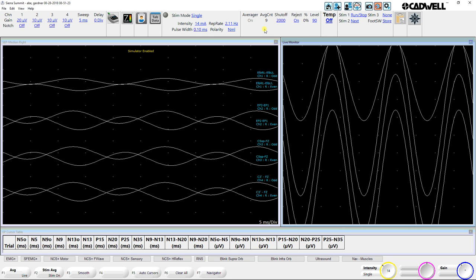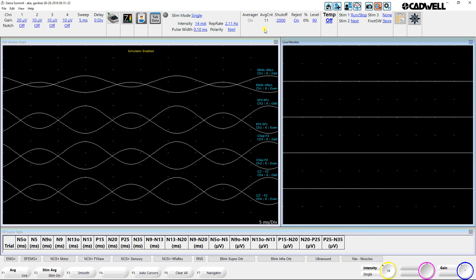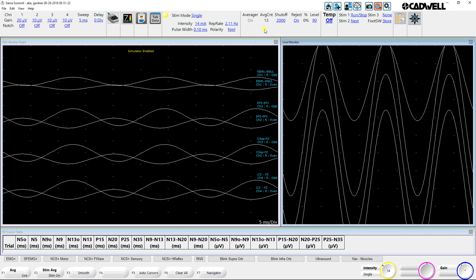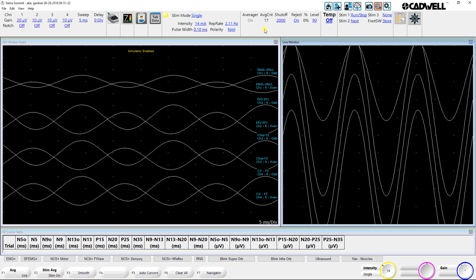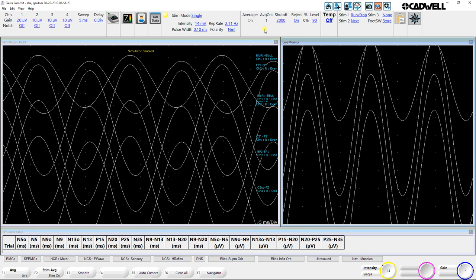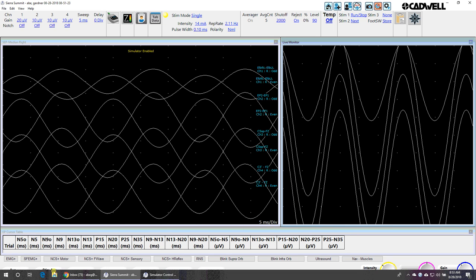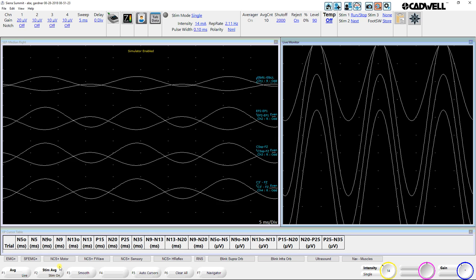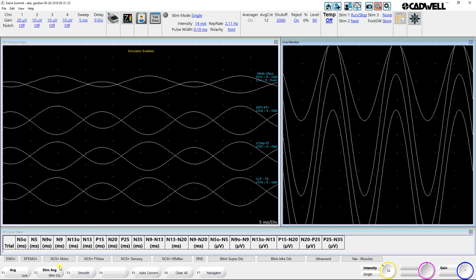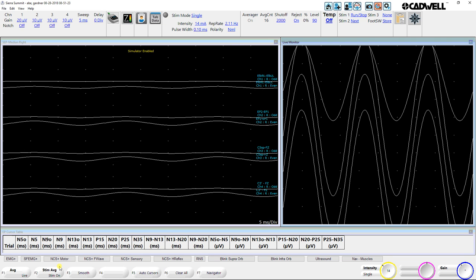At any point during the test, you can run stop to pause, and then run stop again to continue, or you can delete to reset your average count and reset your averages. I have F2 set to stim on average. That means it's only stimulating when you're running. If F2 is set to stim on, then it continually stims regardless of whether you're running the test or not.